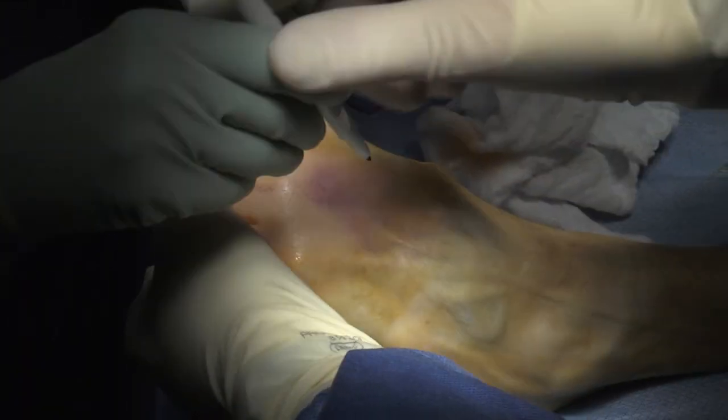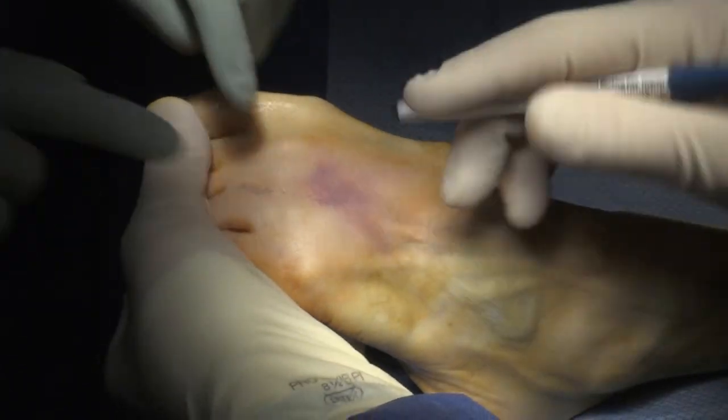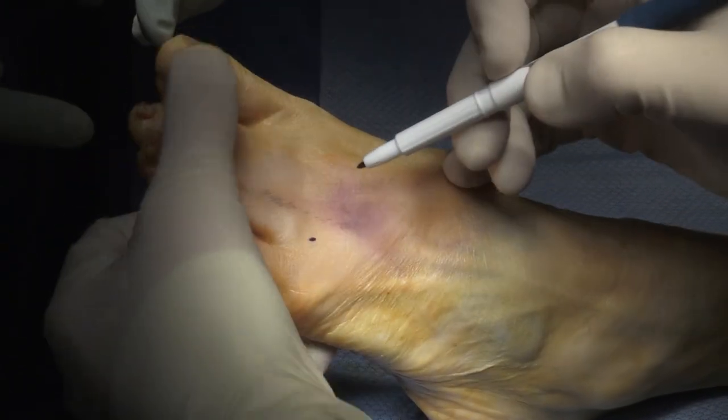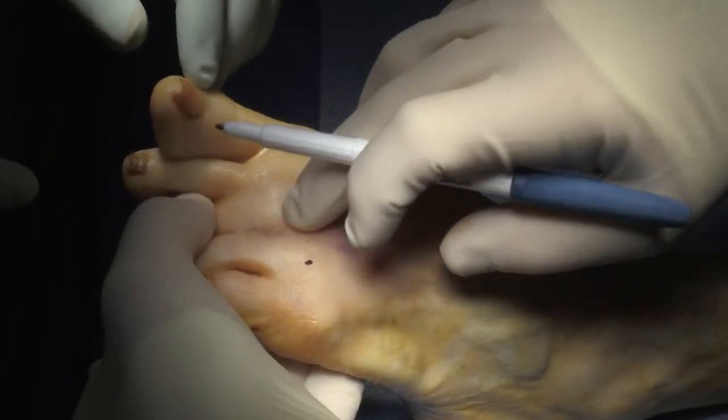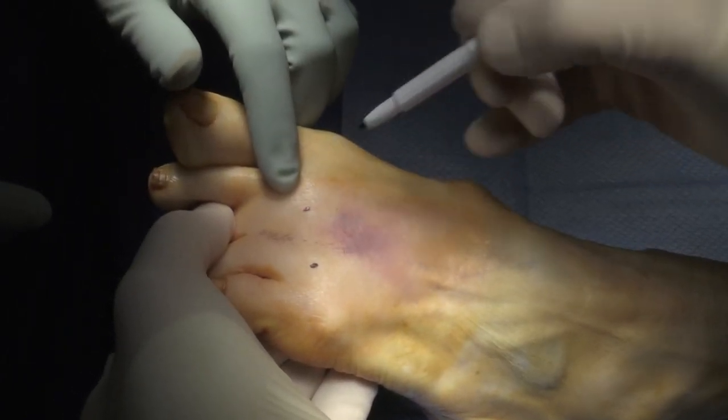I just bend the toes down. Now you can see the metatarsal heads right there. So I got five, got four. We're going to put a dot on three. And then there's another one there somewhere about in there.